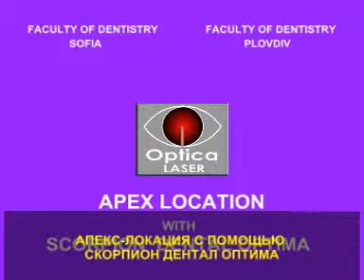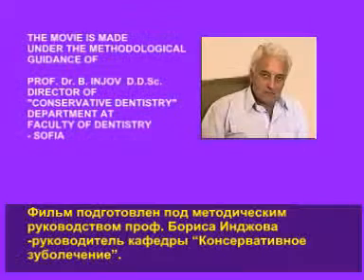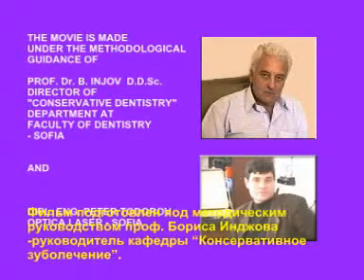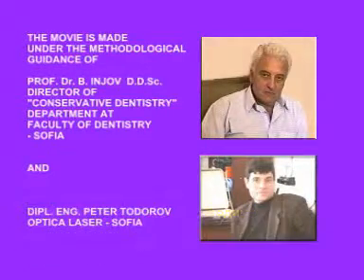Apex location with Skorpion Dental Optima. The film is made under the methodological guidance of Professor Boris Injov, Doctor of Dental Science, Director of the Conservative Dentistry Department at the Faculty of Dentistry, Sofia.